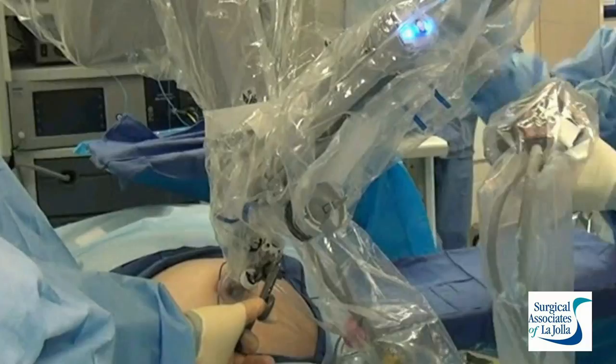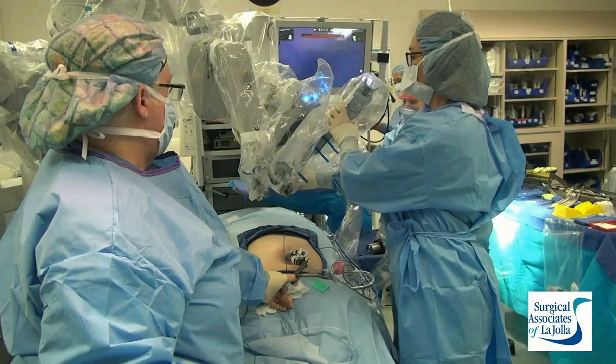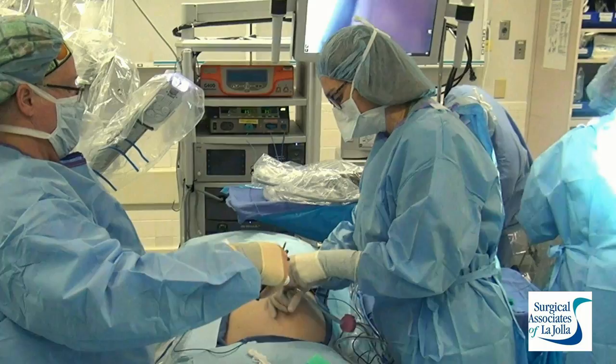Once we have the robot completely disassembled, we separate the camera, which gets sterilized, and the plastic cover keeps the rest of the camera head sterile. They'll back up the robot now that we've undocked. It's important to know that we can never move the patient while the robot is docked. There's a new table coming out that will allow us to do that, but with this setup we cannot.